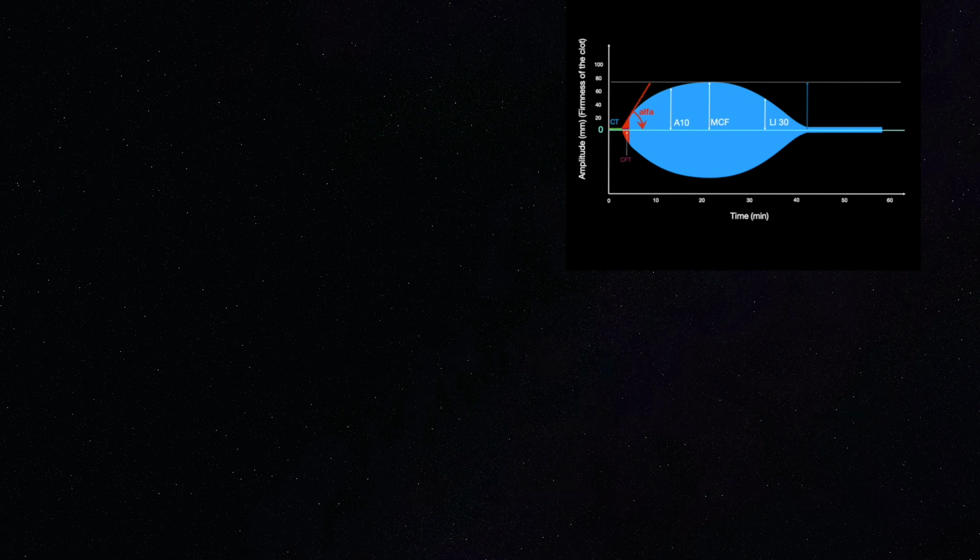Now that we know the normal physiological form of the ROTEM record, we will continue to look at what the records look like in the various assays in which the ROTEM investigation yields results.